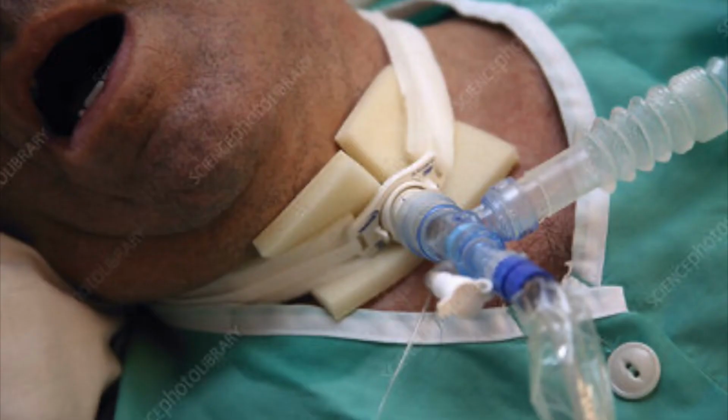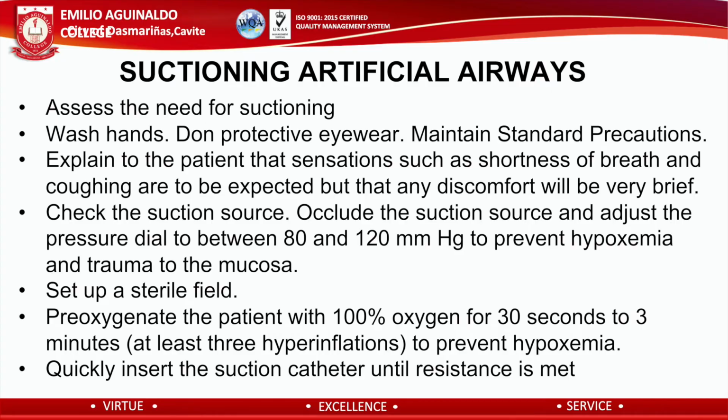So, first, assess the need for suctioning. Assess for audible or noisy secretions, crackles or wheezes heard on auscultation, patient restlessness, increased pulse or respiratory rates, or mucus present in the artificial airway. Because routine unnecessary suctioning causes mucosal damage, bleeding, and bronchospasm.